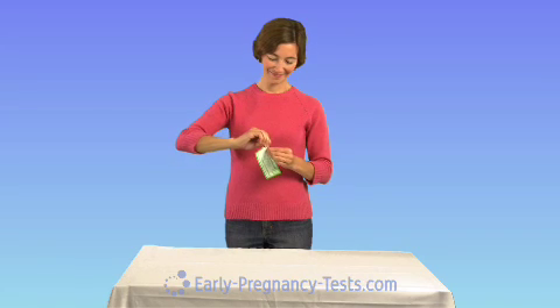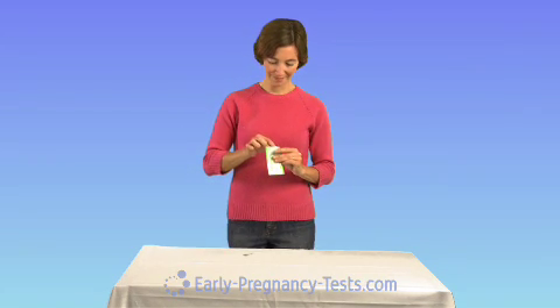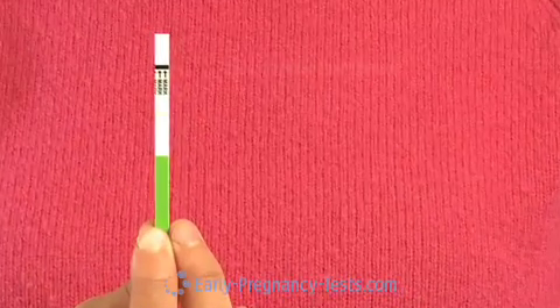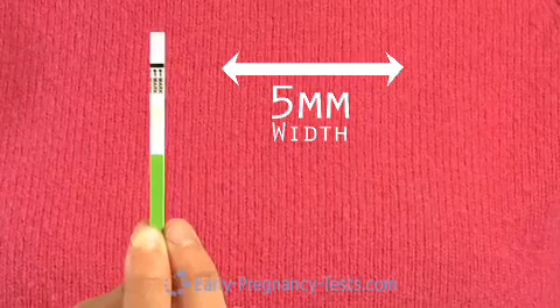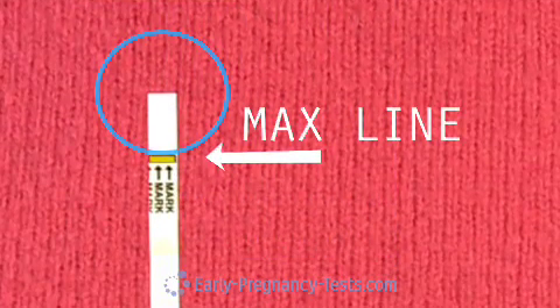To use the test, simply remove the test strip from the pouch and hold it by the green handle portion of the test. Our test strips are five millimeters in width, the widest format of test strip, which makes for easier interpretation of results. This is the portion of the test that will be dipped in the urine. Be sure to avoid immersing it beyond the max line.